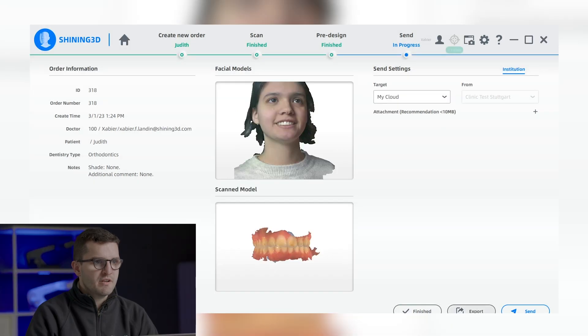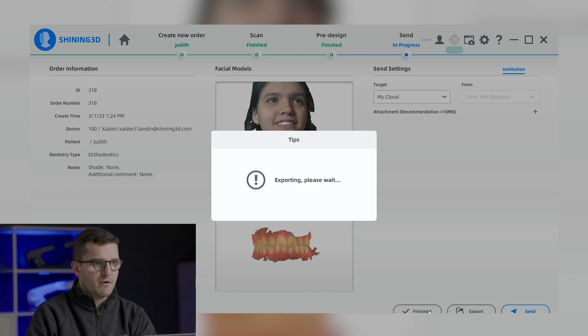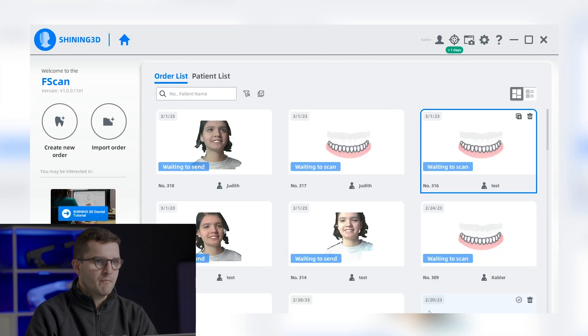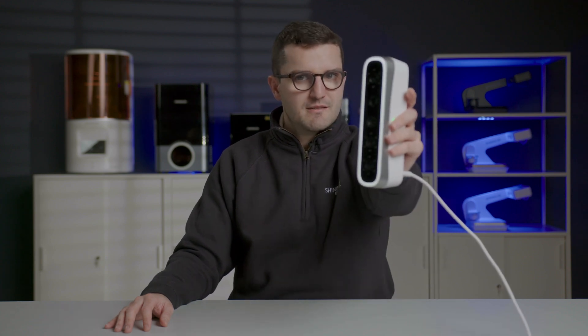By pressing finish, I would end up with my order and get back to the software's homepage. As you saw, the MediSmile is incredibly user-friendly, efficient, and precise. We are confident that it will be an invaluable asset to your practice, and we can't wait to see the incredible results that you will achieve with it. Thank you for joining us today, and we look forward to your feedback on our latest product. See you at IDS.